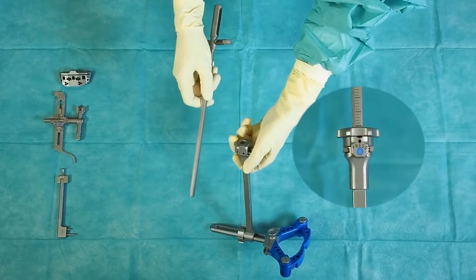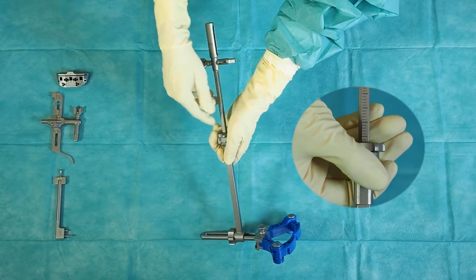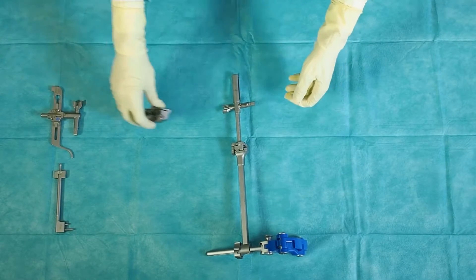Push on the handle adjusting wheel to release the locking mechanism. Engage the holding rod in the handle. Release the wheel when the desired level is reached.